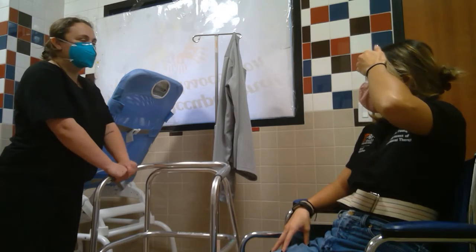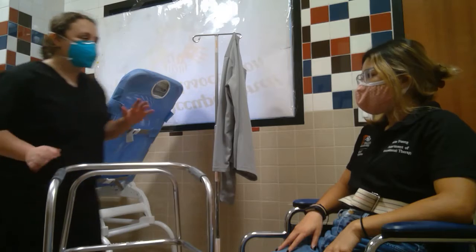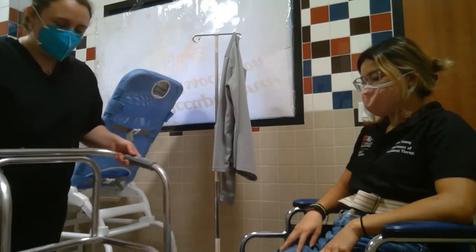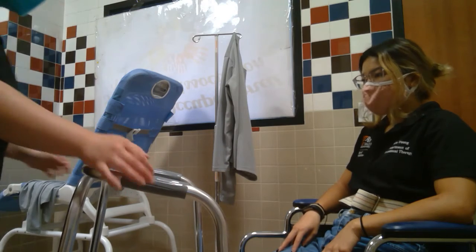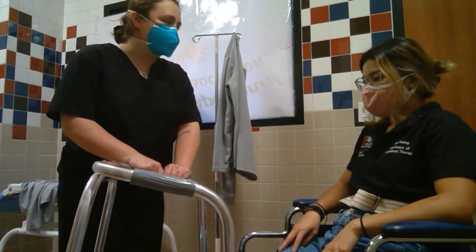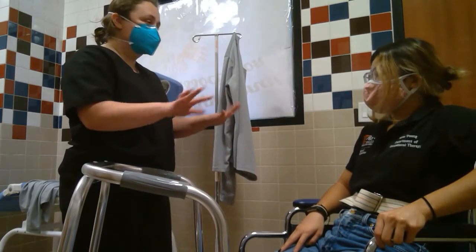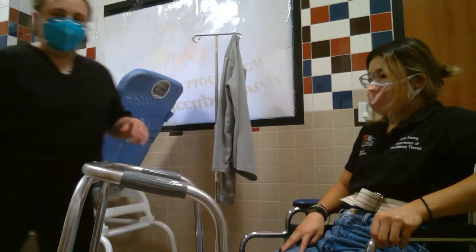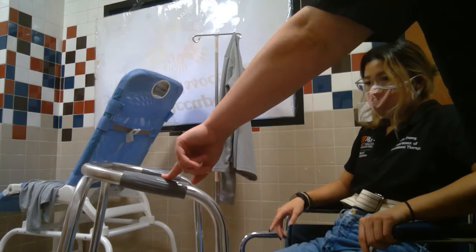And so now this time I want you to try, I'm not going to help you up this time, okay? I want you to get up out of the wheelchair yourself, okay? And so we're going to place the walker in front of you. And what you're going to do, don't pull yourself up on this, okay? You're going to push up using the wheelchair, and I'll be right next to you in case you feel off balance. But you're going to push up off the wheelchair like you did, and then you're going to reach for the walker, all right?